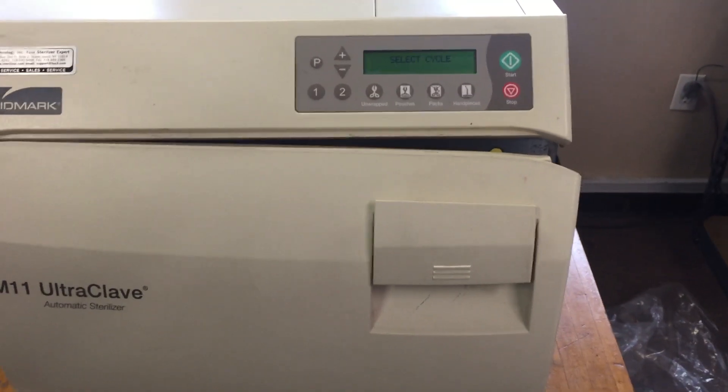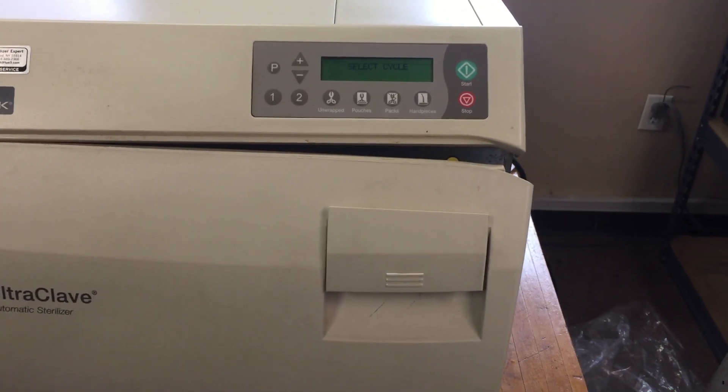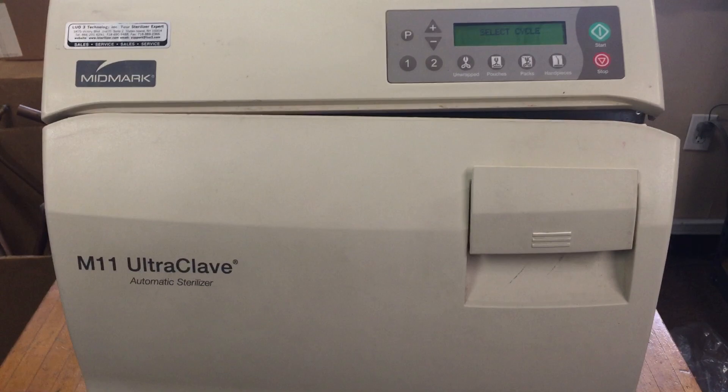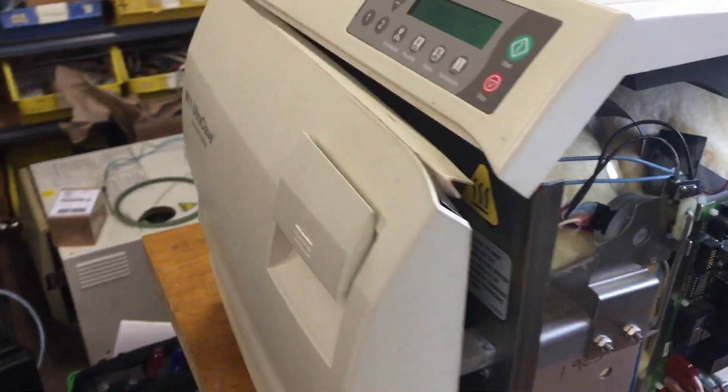Hello, good morning. Welcome to iSterizer.com Technical Support. This video will show you how to repair Midmark sterilizers, the Midmark M9 and M11. M9 and M11 — most parts are exchangeable. Both machines are very similar.